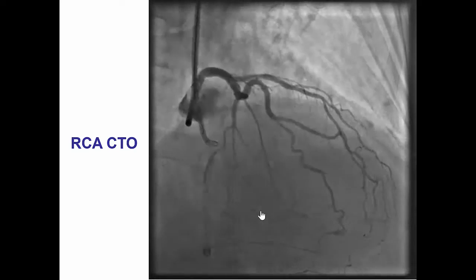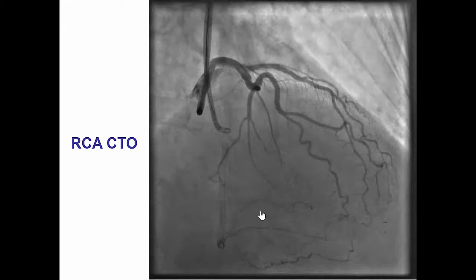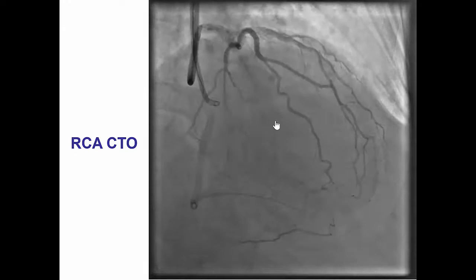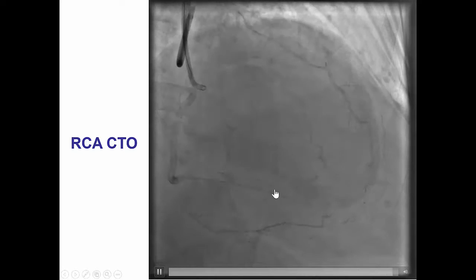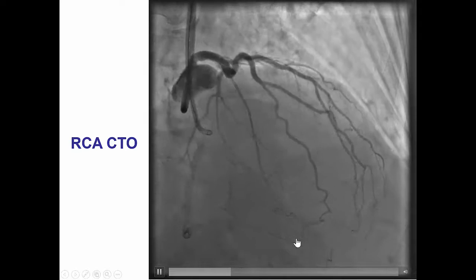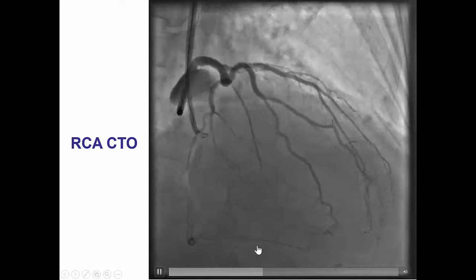RAO view demonstrated that there was filling of the PDA through an epicardial collateral from the circumflex.